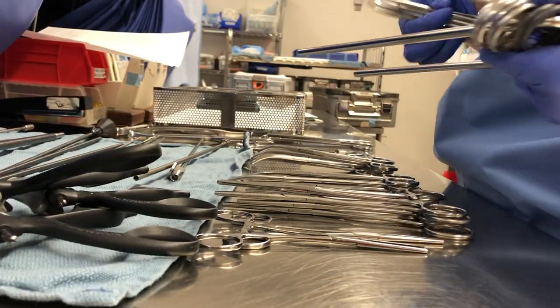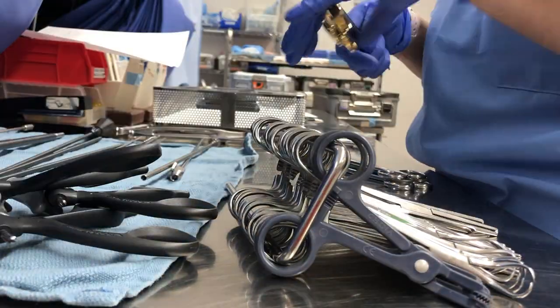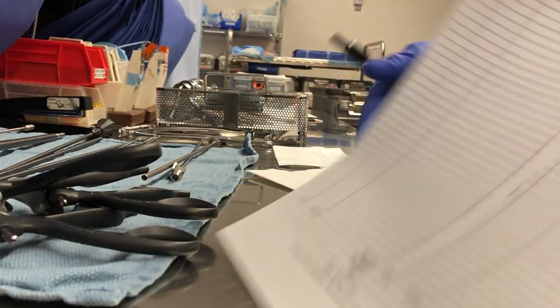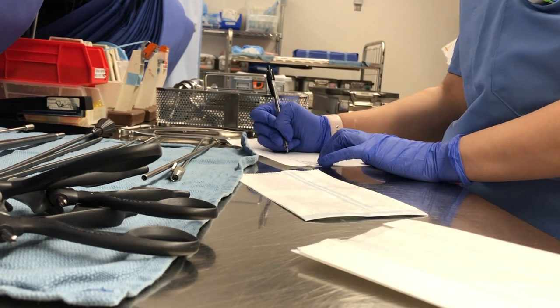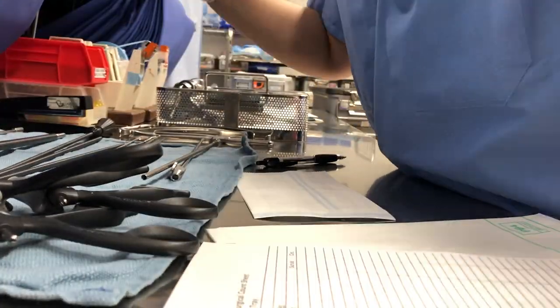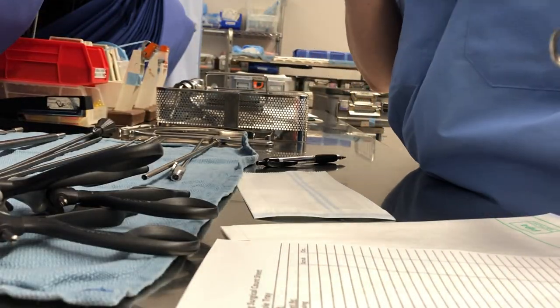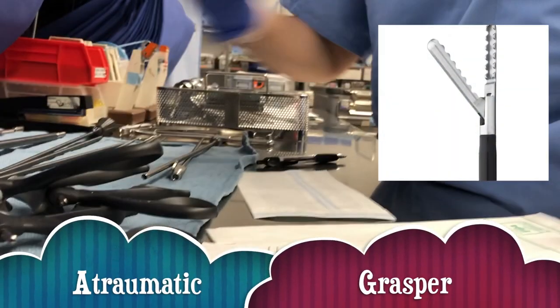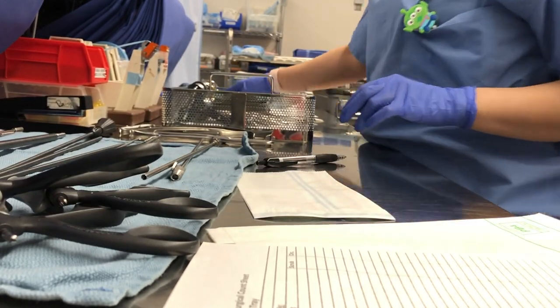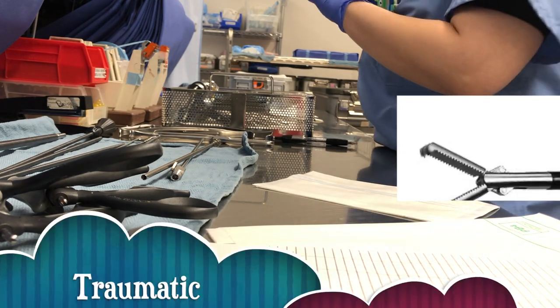Here I am putting all the instruments on the stringer as they appear on the pick sheet. Next on my list are two atraumatic graspers — atraumatic graspers are graspers without teeth. I set them in the tray nicely. Whenever a tray is messy, especially as a tech, I know how annoying that is. It's much easier when your tray is organized.